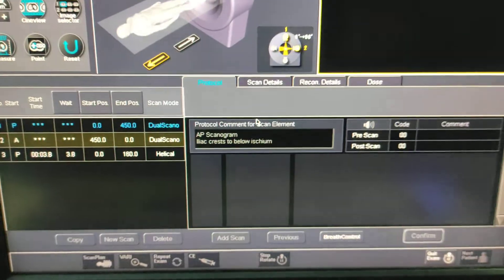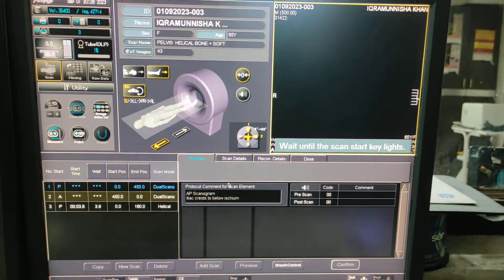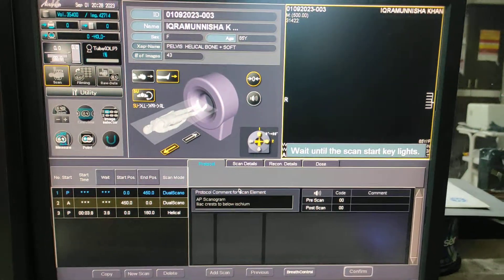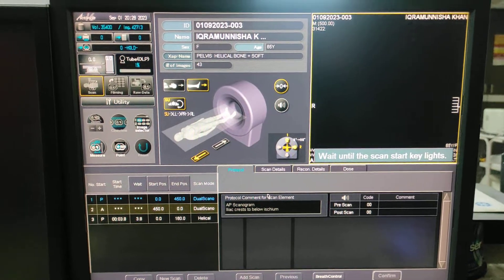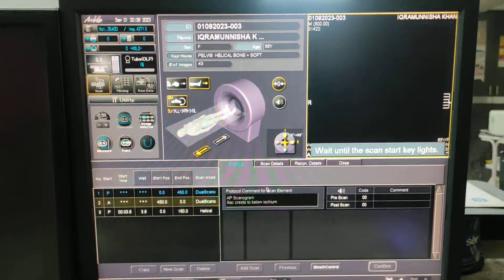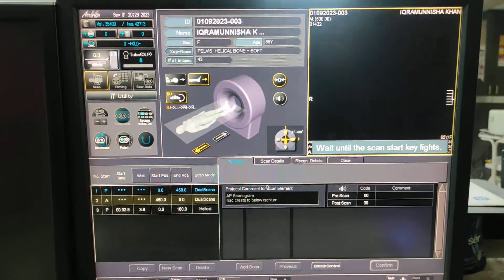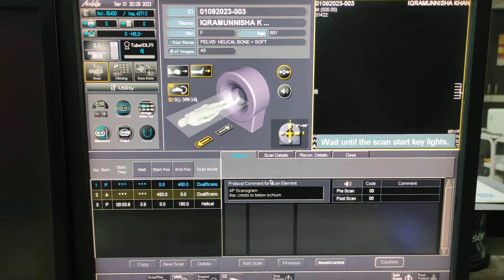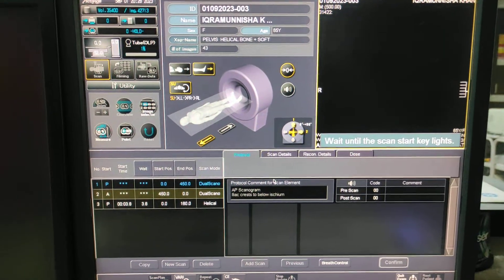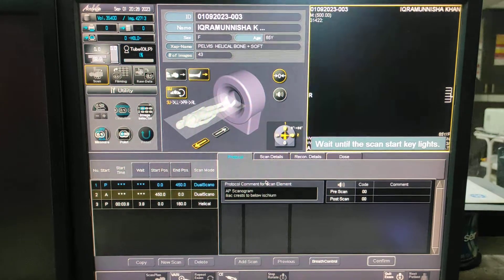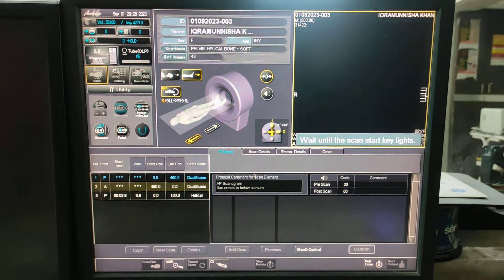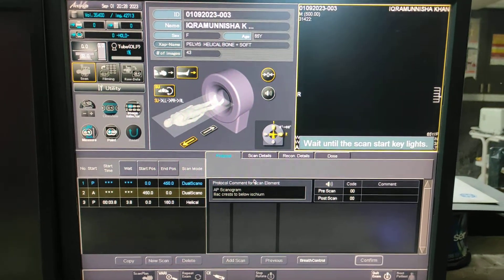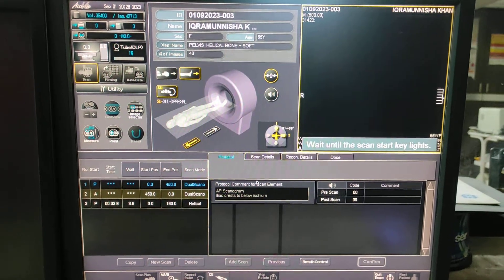Click on the protocol and wait until the scan start key lights up. Before scanning any study, you have to take a proper history — whether the patient has a history of a fall or only a complaint of pain. First of all, we will take a scanogram.